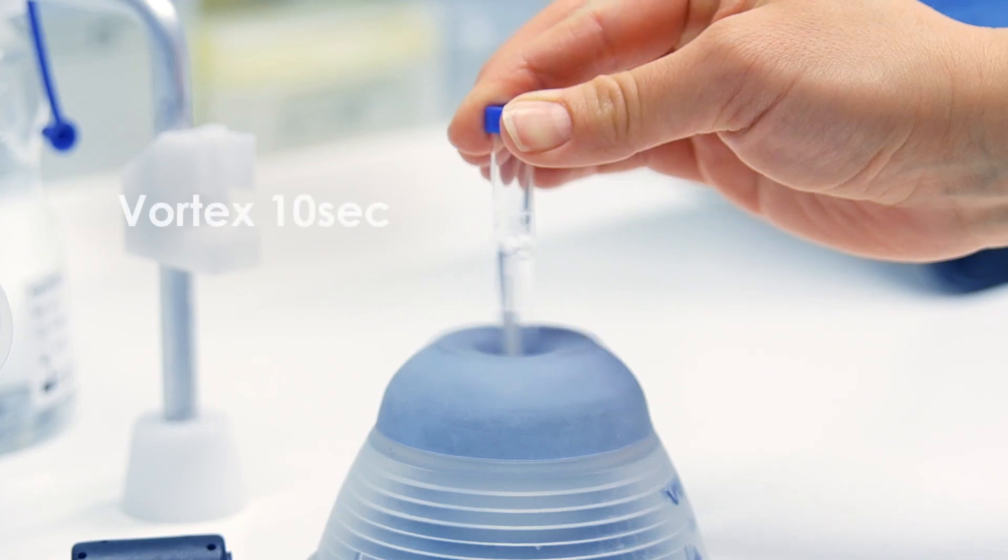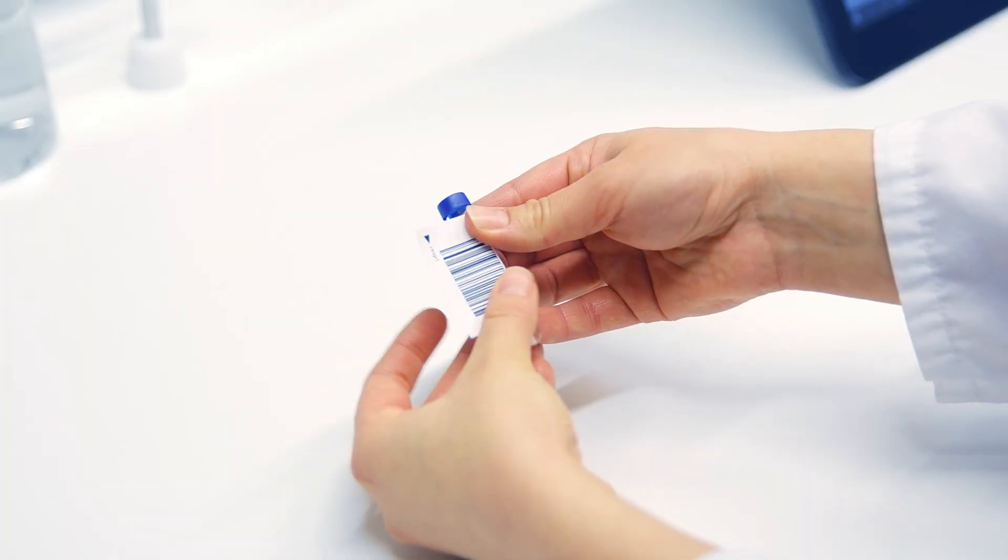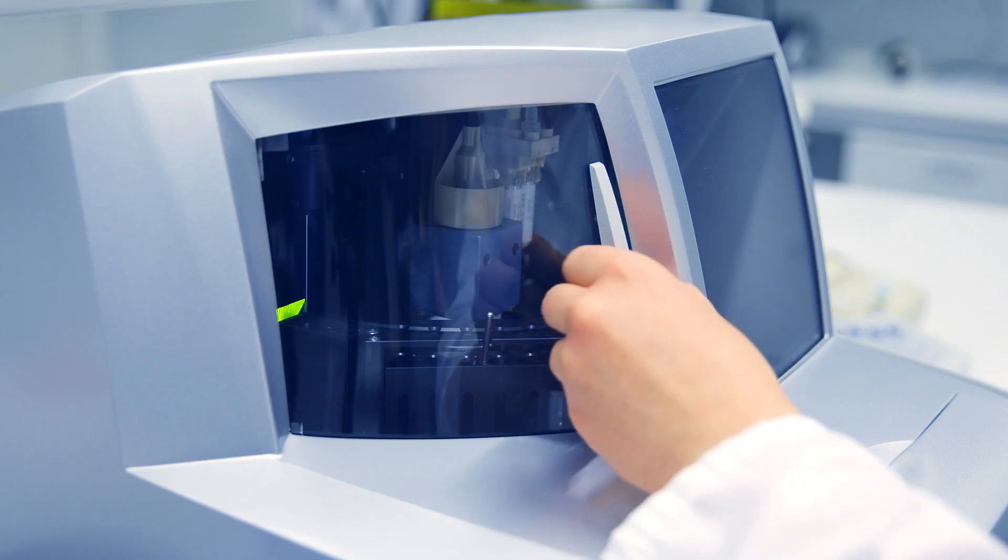Next, vortex the sample for a few seconds. Vortexing releases the sample into the buffer. The workflow is simple and no laboratory expertise is needed.